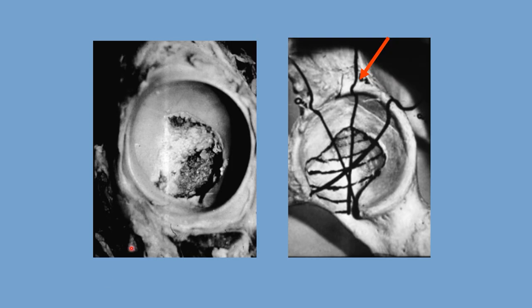In this image we can see the acetabulum. The human acetabulum is more shallow anteriorly than posteriorly, and this is part of human evolution. Professor Graf emphasizes how important it is to measure hips and compare hips in the same place. This place he called the standard plane. It is a 2mm area in the middle of the socket exactly. If you measure at the front it will probably underestimate the coverage; if you measure at the back it will probably overestimate the coverage.